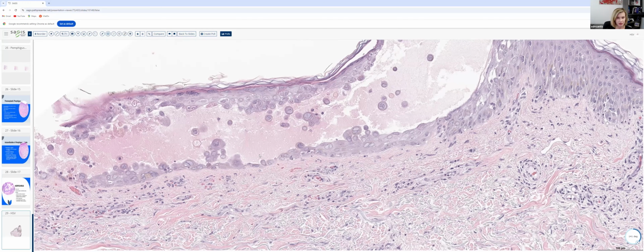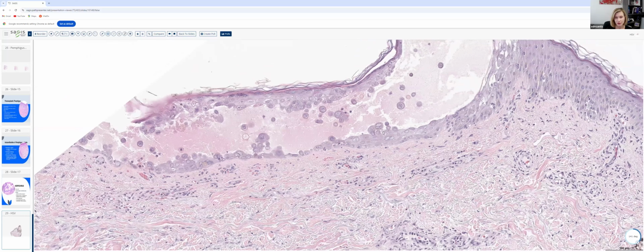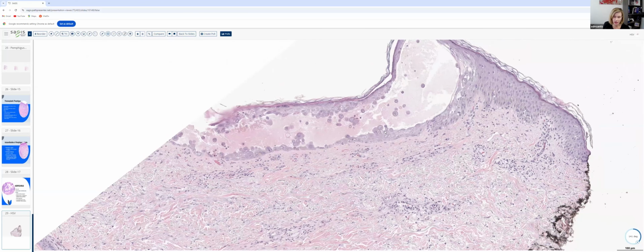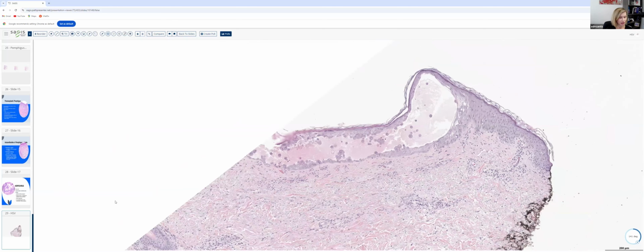and molding. So this is an example of herpes, and we could perform immunohistochemical stains for HSV1 and 2 and varicella zoster if it isn't clear clinically which one of those is the pathogen, or we could just sign this out as herpes virus infection.